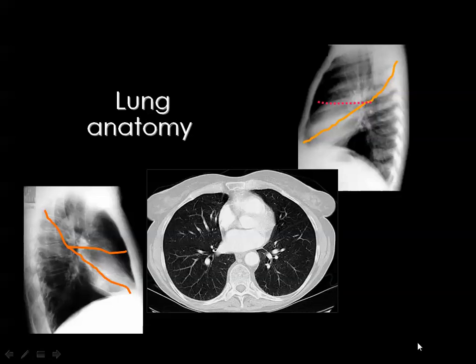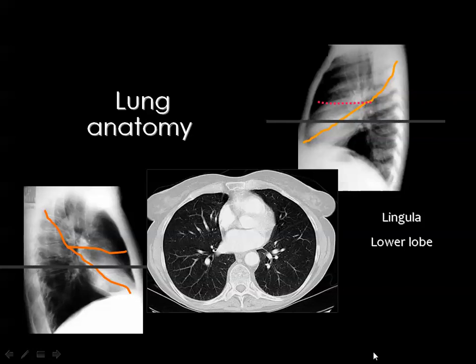Going lower — at the level of the heart — on the left side you see the lingula anteriorly and the lower lobe posteriorly; on the right side you see the middle lobe anteriorly and the lower lobe posteriorly. The lingula and middle lobe each represent approximately one-third of the thoracic diameter. A line dividing the thoracic cavity into anterior one-third and posterior two-thirds: the anterior one-third on the left is the lingula, on the right is the middle lobe, and the posterior two-thirds represents the lower lobes.